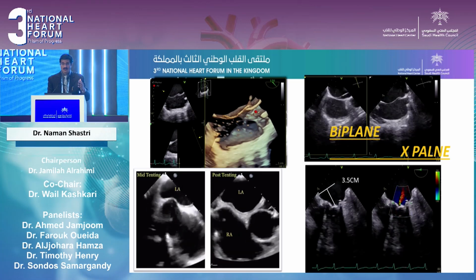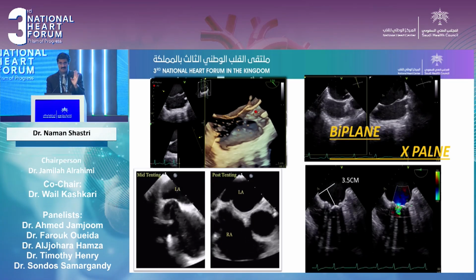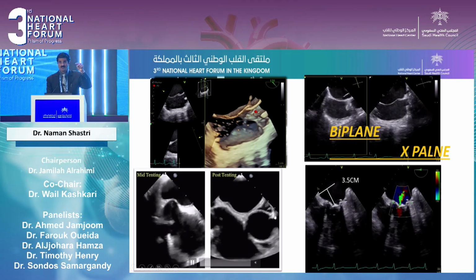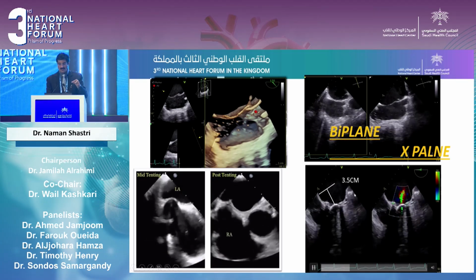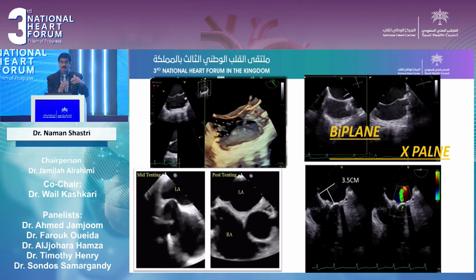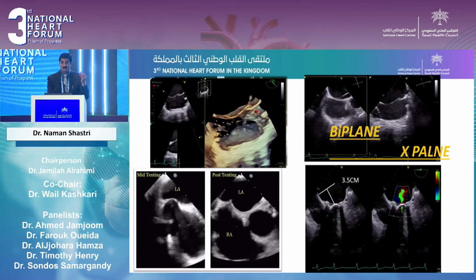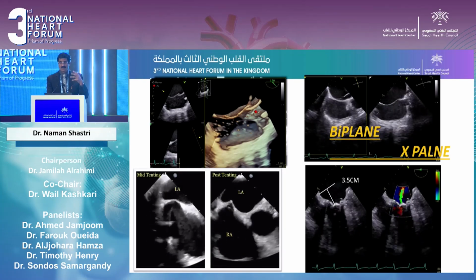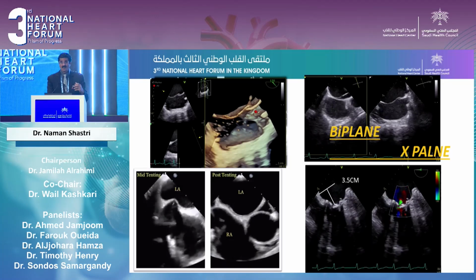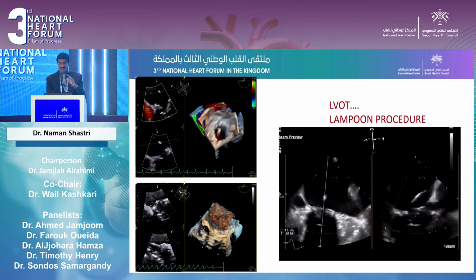If you do mitral clips, it should be about 4 to 4.5. But in the case of a bioprosthetic mitral valve, the distance from where the septum is punctured to the level of the bioprosthetic mitral valve should be at least 3.5 centimeters. So these things have to be reported. Once everything is clear by looking at the PPM, patient-prosthesis mismatch, septum, coronary artery evaluations, other valves, and other pathology, then only can we shift the patient for further evaluation with CT.